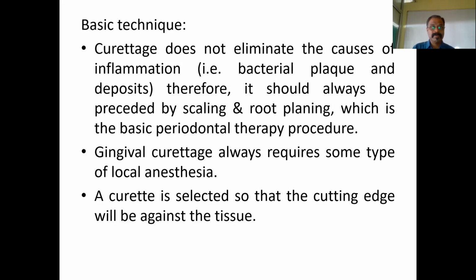The first and foremost thing is to give adequate anesthesia to that area, because you are going to do a little bit of an invasive procedure using a curette going deeper down into your tissues. So always give a local anesthesia, in the form of local infiltration or a regional block. Then the instrument preferred, as the word says curettage, is always a curette, right?